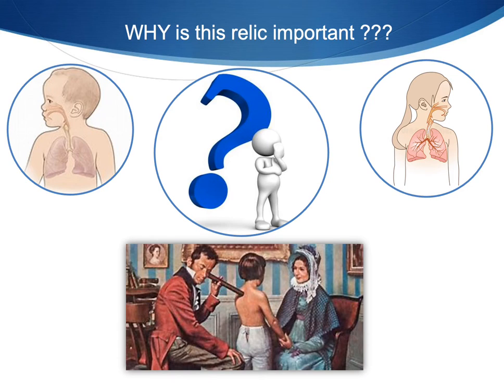Okay, why is this relic, the precordial stethoscope, important to me, the modern day anesthesia provider? Nothing can be more restrictive than a continuous monitoring of breath sounds through an earpiece. Nevertheless, every anesthesia practitioner is aware of those critical moments of airway uncertainty at the beginning of the case or at the end of every general anesthetic. Continuous monitoring of upper airway sounds during those times can either be very reassuring or they can trigger a more appropriate and timely intervention.